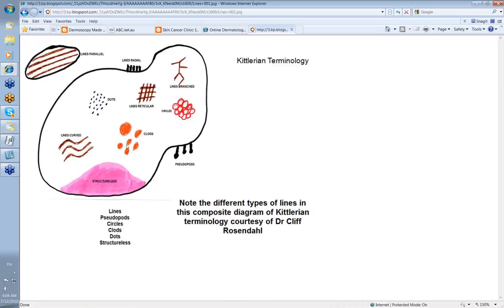Let's look at the different types of lines. These are lines reticular, these are lines branched, these are lines parallel seen on the palms of the hands and soles of the feet. These are lines radial, and you can also have lines radial meeting at a point — lines radial meeting at a point peripherally are often a feature of basal cell skin cancer. There's also lines curved, and we'll be dealing with these in a separate video.